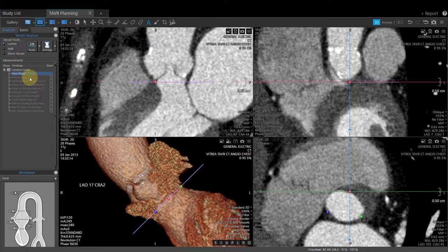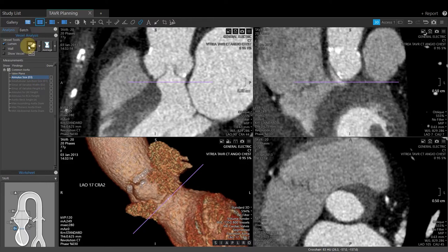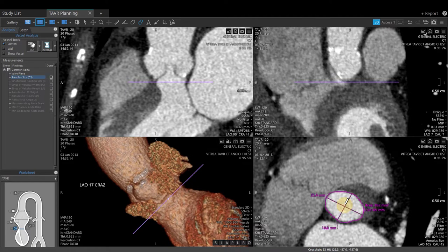Left-click to activate the annulus size measurement. Note the ROI tool has been activated. In the short axis view, there are two ways to create this measurement. One is a double left-click in the middle of the vessel, which will automatically detect the contours. If this is a good quality exam, the software will do a good job detecting the contours automatically.